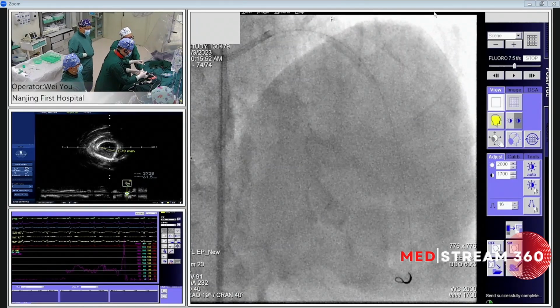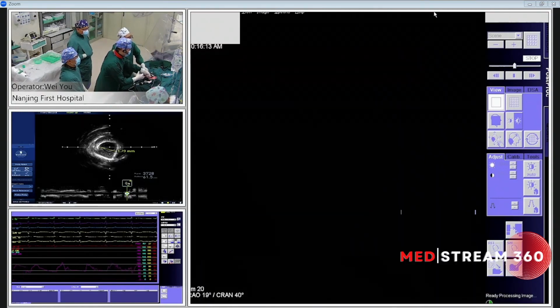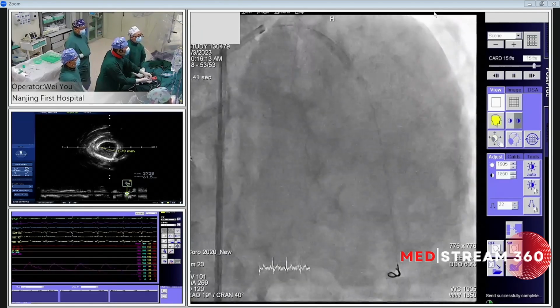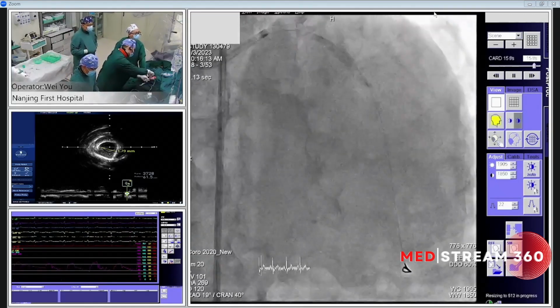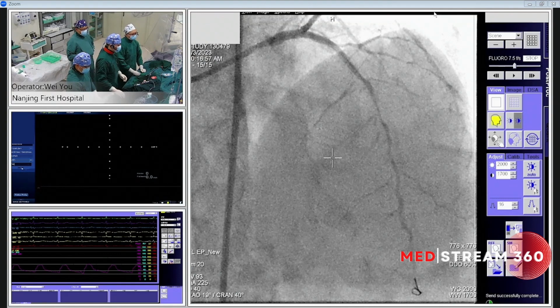Let's see the ECG monitor. In lead aVR, there is ST segment elevation. Please take a picture. Seems very good. I think we lost a very small third diagonal, but the first and second diagonals are still there. Maybe some spasm of the vessels. You can also see the ST elevation in aVR is better resolved. This may be spasm after rotablation and the IVL treatment.